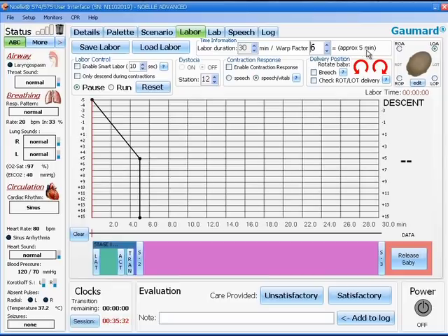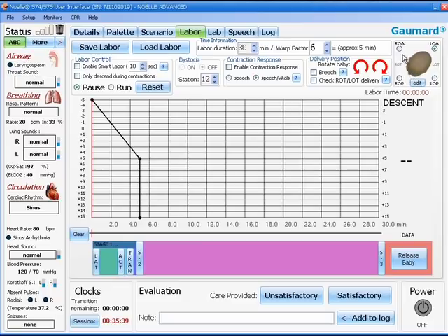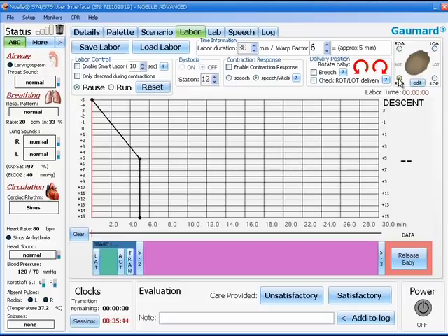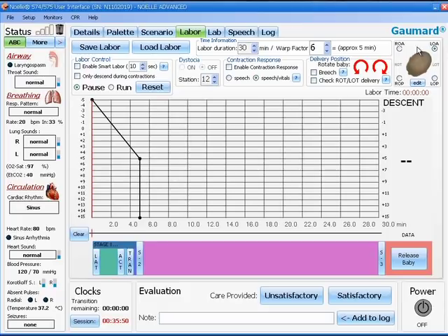To the right of that box, you will see a picture of the baby's head. And if you click the four dials in the four corners of that box, you will notice the baby's head changes position. This is how you tell the software how you align the baby when you set it inside the mannequin.